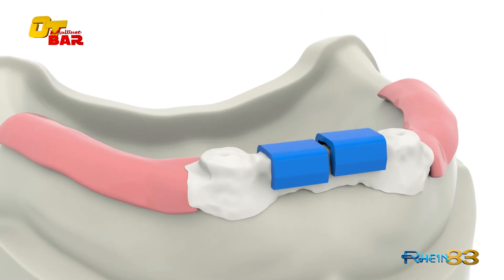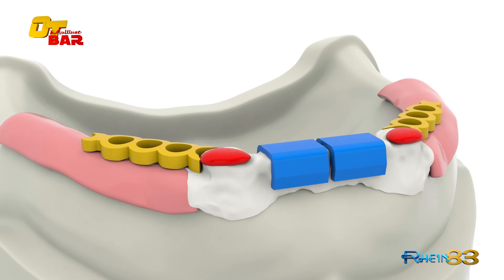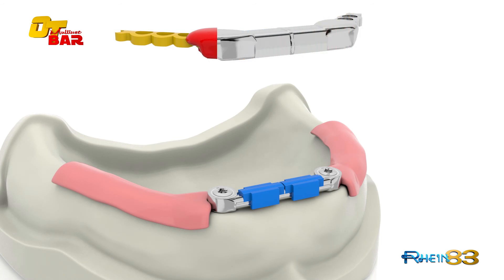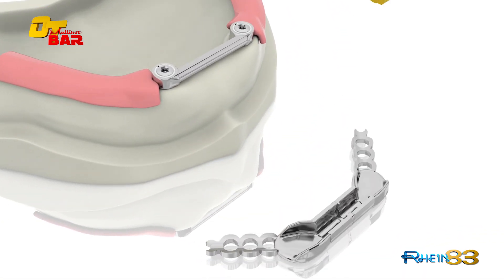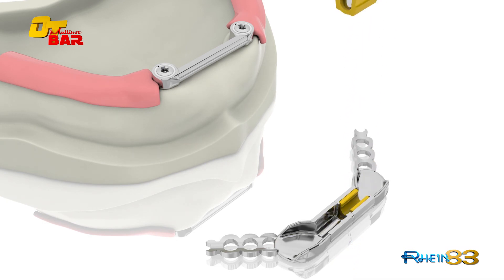Use the connector to extend the frame and complete the structure with self-curing resin. Remove the silicon tape from the castable frame and cast. Insert the proper retentive clip into the frame and finish the denture.